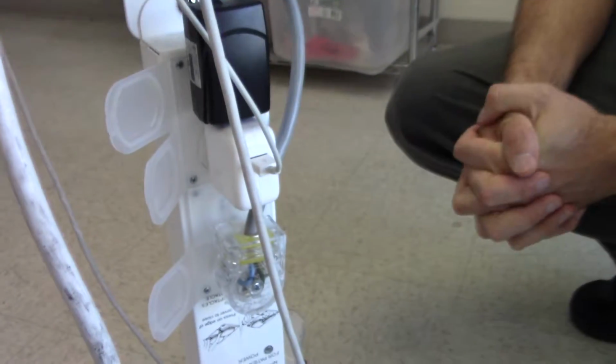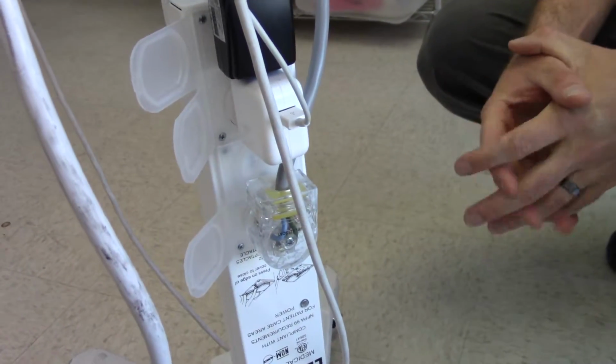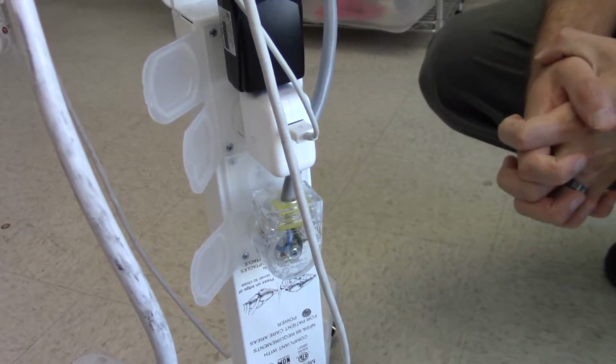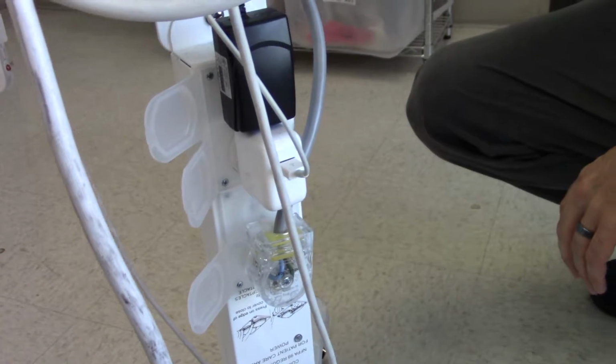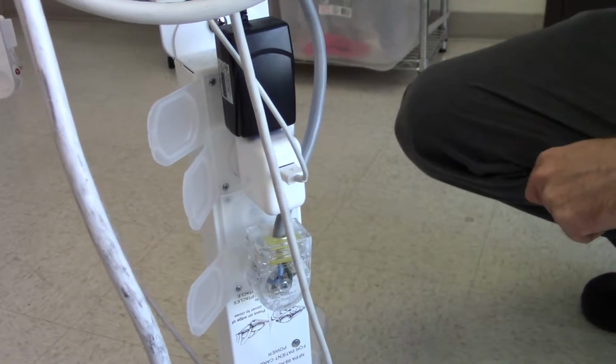How often does that happen? Probably once about every 3 months. 2 or 3 months, I'd say. It's not one Apple charger every 2 or 3 months, or per unit? No, it's not. I mean, it's not that often, but it does happen. It's a dribble. It's still something that we have to deal with.